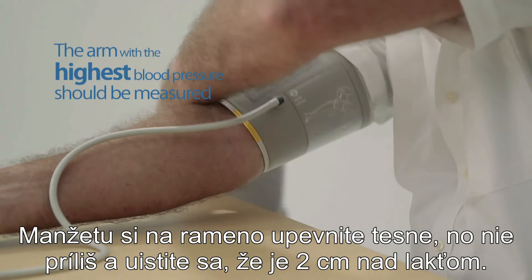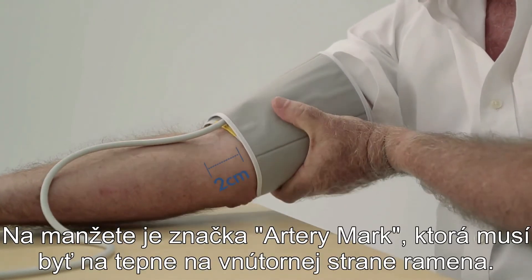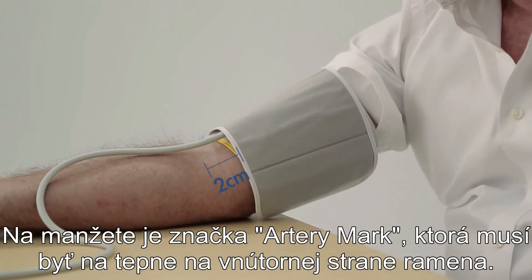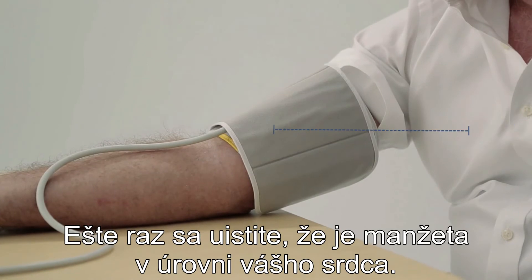Fit the cuff closely but not too tight. Make sure the cuff is two centimeters above your elbow. The artery mark must lie over the artery which runs down the inner side of the arm. Ensure that the cuff is at the same height as your heart.